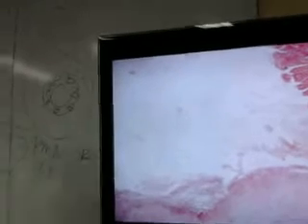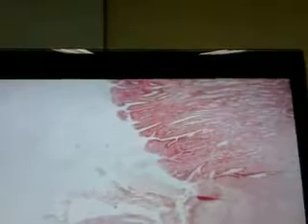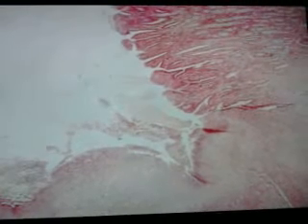Microscopically, there is a great inconsistency of the epithelial lining from the base of the ulcer towards the serosal surface. The following layers may be distinguished. So I will ask you, from top to bottom, to identify the layers of the ulceration. This is a nice picture. This is the normal side, and you see that in this area, we're able to appreciate the mucosal epithelial lining. Okay? What you see now here is necrotic debris.